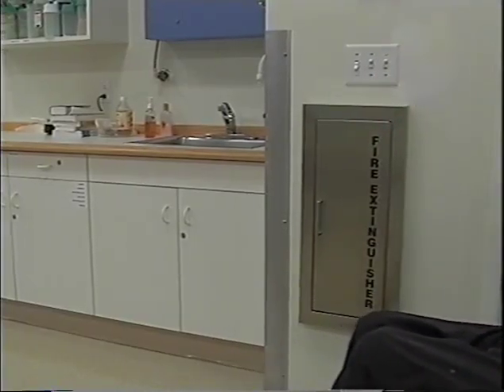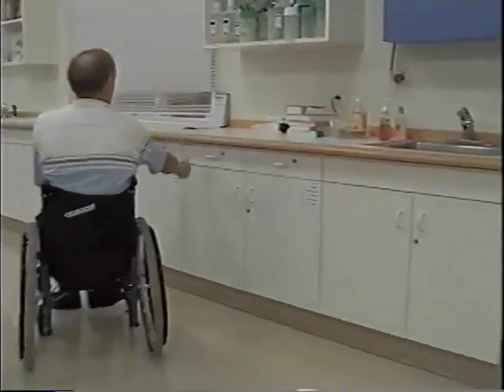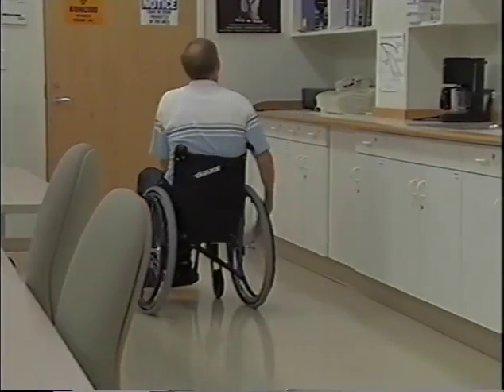One little trick, after you teach cornering and you're teaching them to keep their thumb up, you might want to teach them how to wheel along with just one hand. The purpose of this exercise is that if you're carrying a cup of hot coffee or you injure your arm, you can still wheel around with just one hand. The way that it looks is you push off of an object and then bring yourself back in. Out and then in. And push out and in.